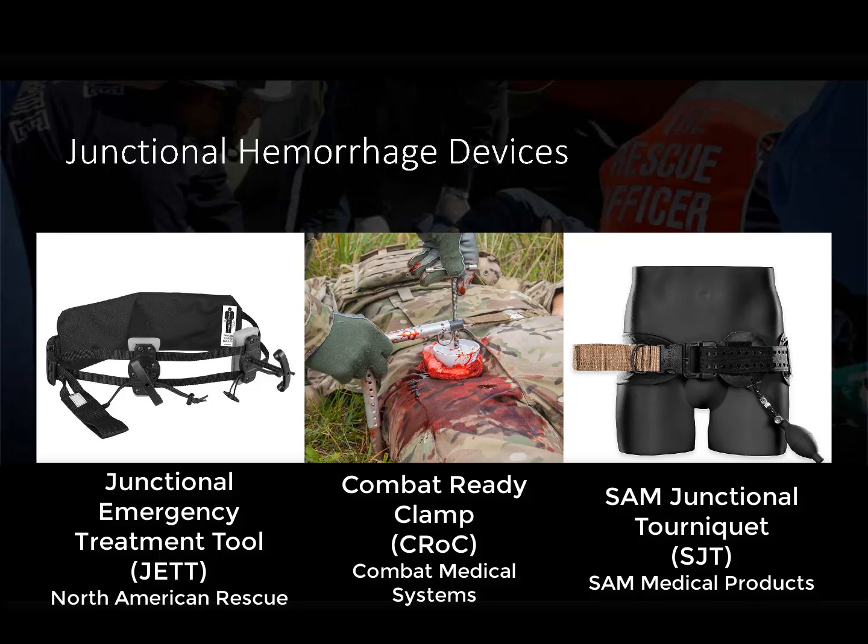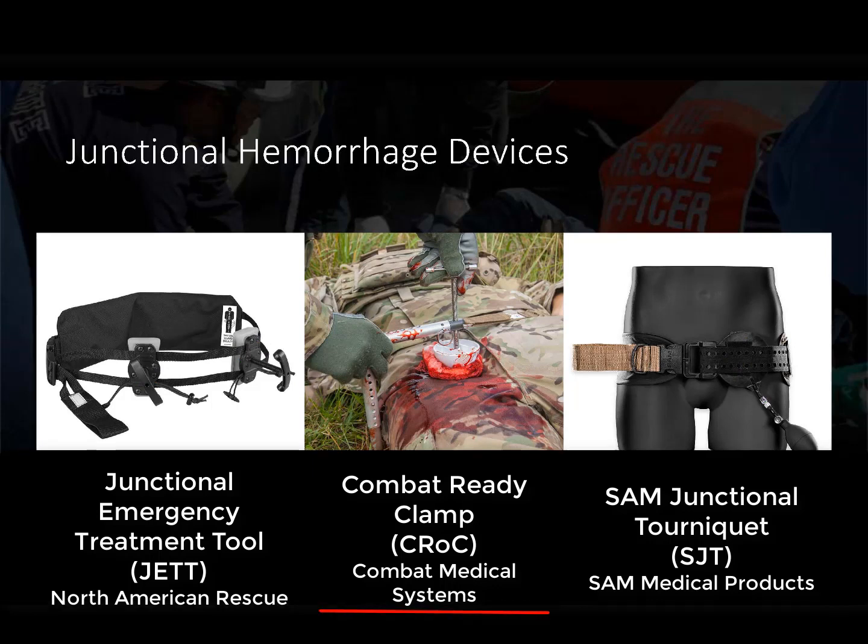Suppliers of these devices include Combat Medical Systems, North American Rescue, and SAM Medical Products. These devices generally have to be purchased with a prescription or medical director authority involved.